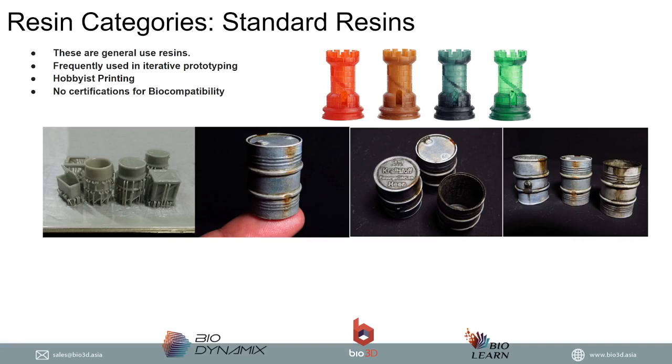And standard resins, of course, will not come with any certifications for biocompatibility. The reason I bring this up is because in the market there are users who are using standard resins for dental or medical grade, and you shouldn't be doing that because they've not been cleared. We do not know if there are allergic reactions, or they may cause some sort of long-term detriment to the patient, or to the client.